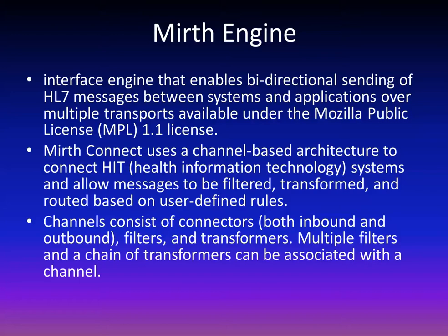One thing that I think is important that I didn't talk about yet is, where do we actually store that radiology report? In the past, they would get the radiology report converted to a PDF and then store it in the PAC system as a DICOM file.